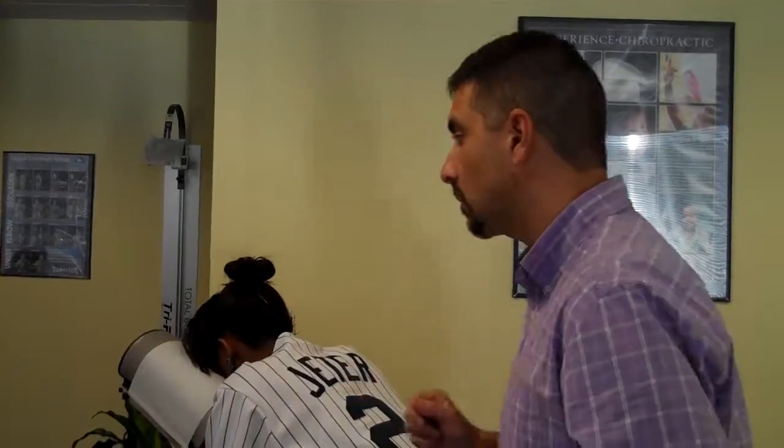Hello, Dr. Maggio here. I want to go through a basic Polestar adjustment with you. So let's go ahead and start with our patient.